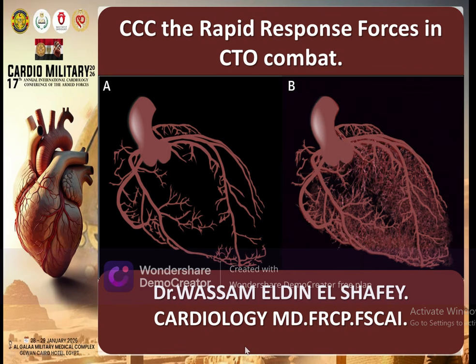Hello. Today our case was presented in the Cardiomilitary 17th edition under the title of Triple C, the Rapid Response Forces in CTO Combat.